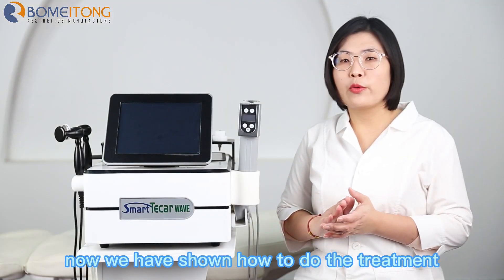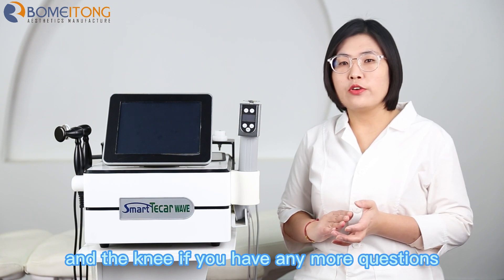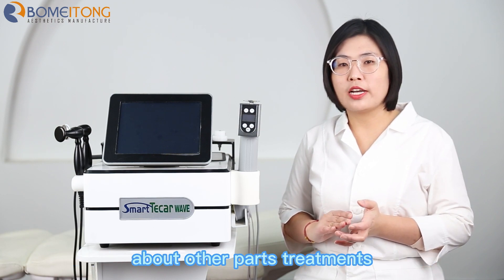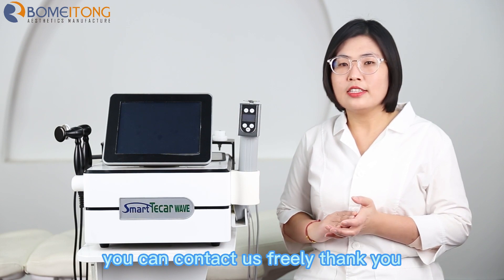Just now we have shown how to do the treatment for the knee. If you have any more questions about other parts treatment, you can contact us freely. Thank you.